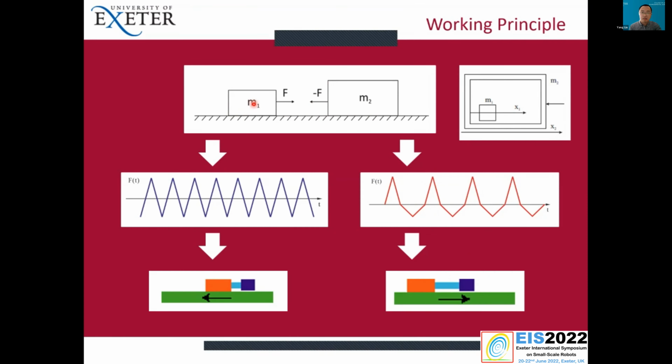Imagine if we put this small mass inside of this bigger mass as a capsule, then we can control the force profile. Then we can control the motion of this capsule and control its direction, either forward or backward. So this is the main principle of our design.